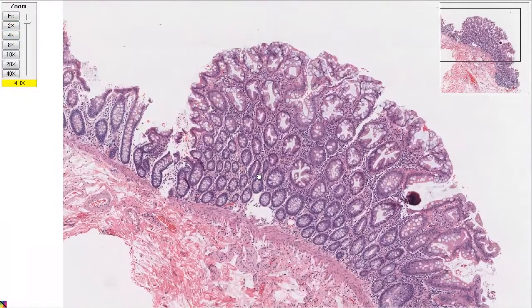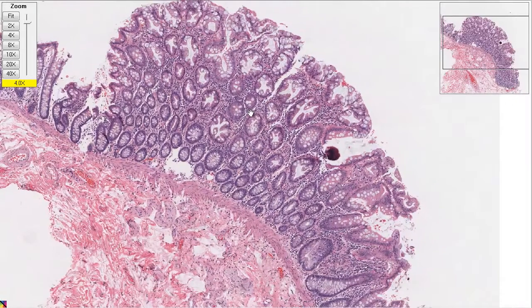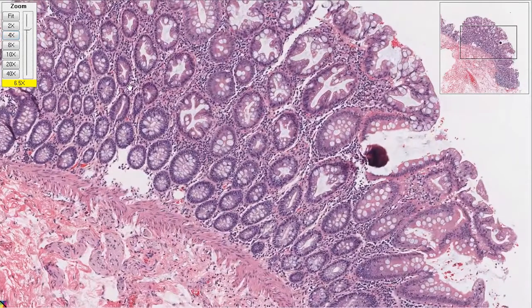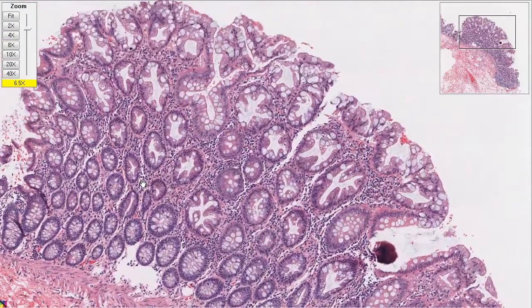What we don't like about it is, we saw before, this is what the normal gland looks like. It's a test tube shape and goes down, and it has these cells which are normal. Now all of a sudden it looks a little thicker here. And what catches our eye also is these aren't just straight test tubes anymore. They divide. They kind of go in and out like that. But they still are test tubes. Just following up on the last video, they just look like circles as opposed to test tubes because we're taking a cross section.